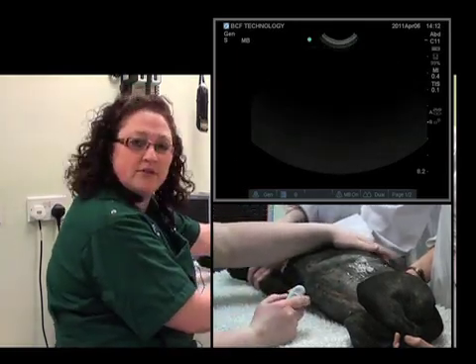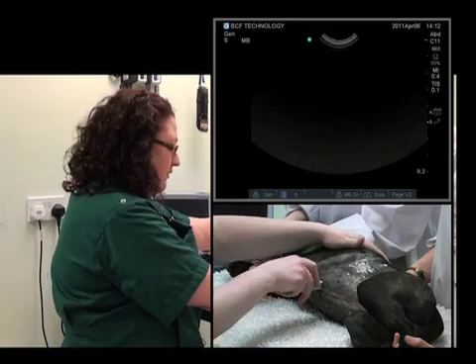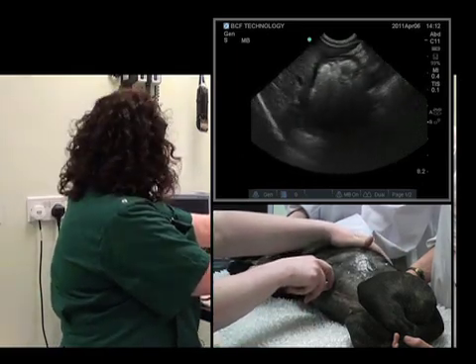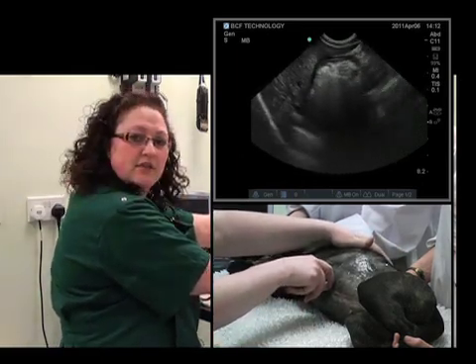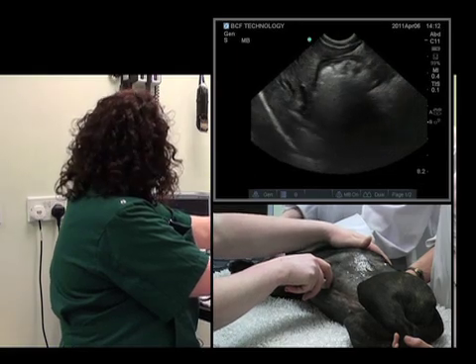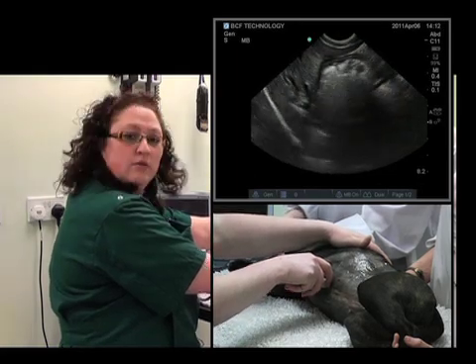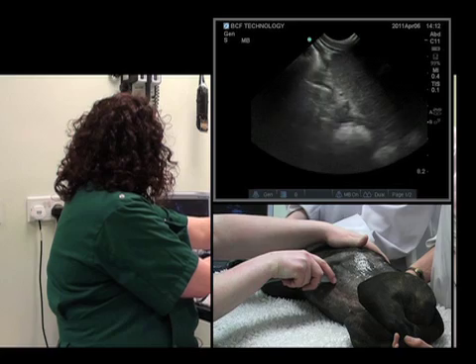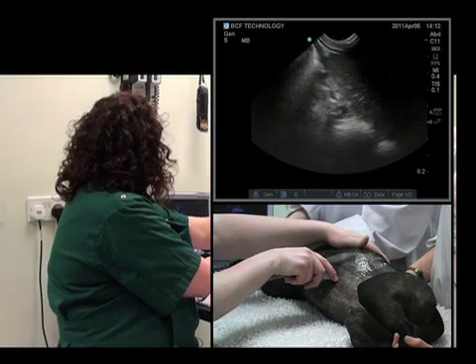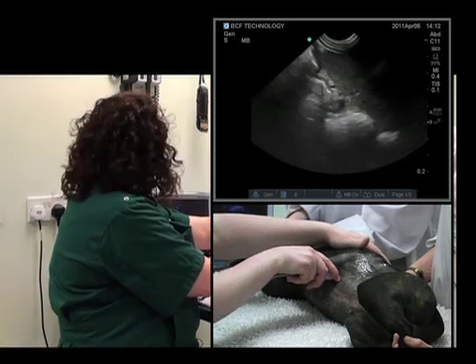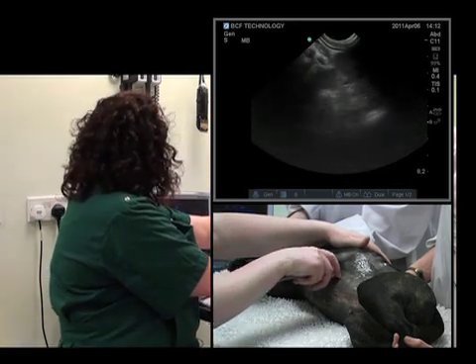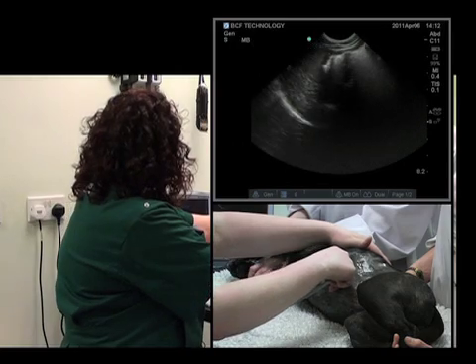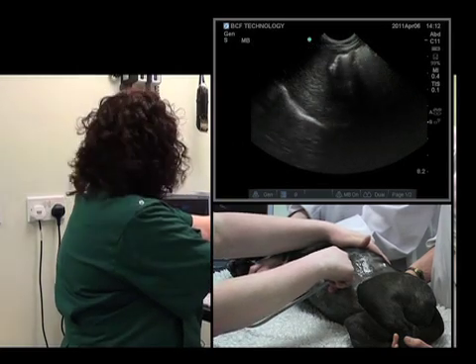We'll want to see it in orthogonal view, so that will enable us to see it in two planes. We'll start again at the level of the xiphoid sternum, and we'll rock caudally to see the pylorus and cranially to see the fundus.